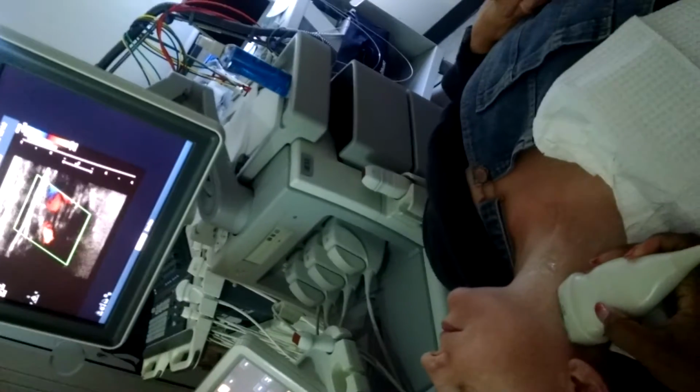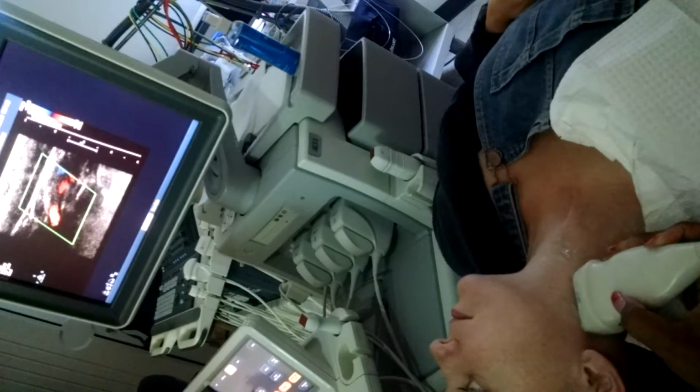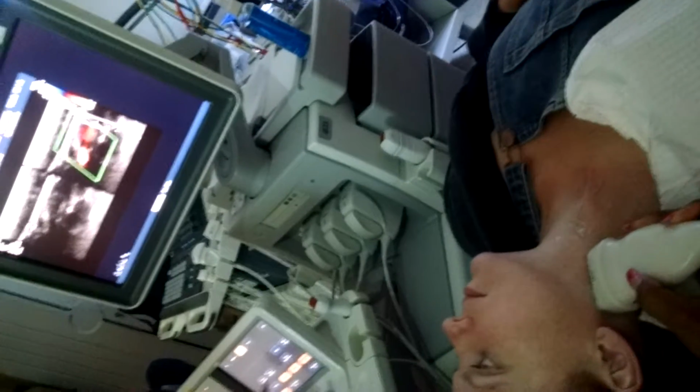Help me out. Who's a knobbologist? Here, steer. Alright, so that's where you start your flip. Okay. Oh, I gotta turn it. Here we go. Alright, so then I can follow. Oh, color compare. Color compare is right here on the color screen. Then you go to color, you'll see it.